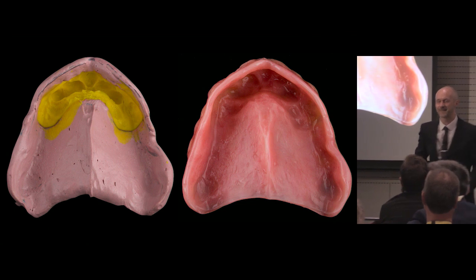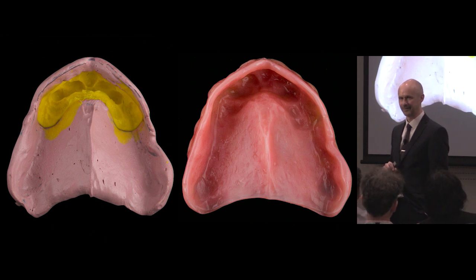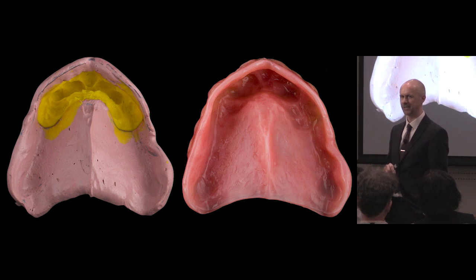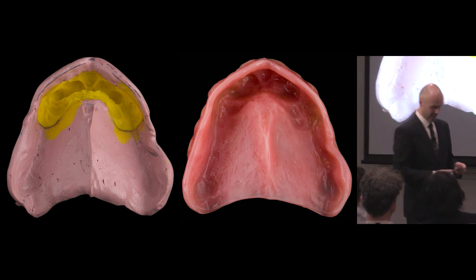Question? Yeah. What's the alternative material if you don't want to use zinc oxide? Impregum, medium bodied, I think is terrific. I love zinc oxide though, the way it flows, it's just fantastic. But that's just my preference, you know.